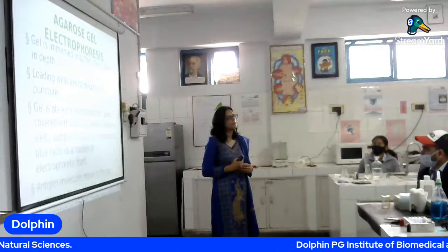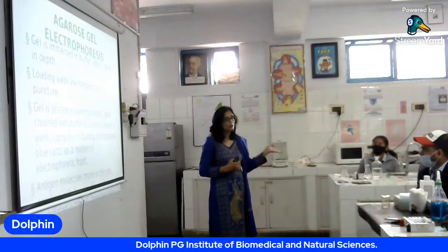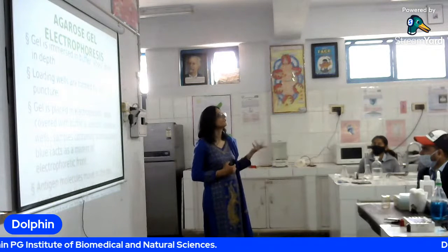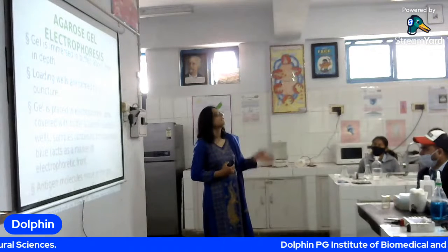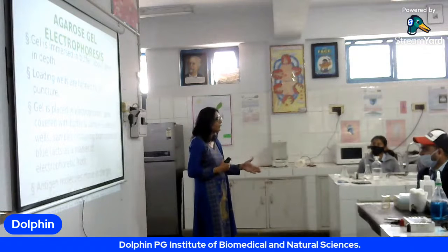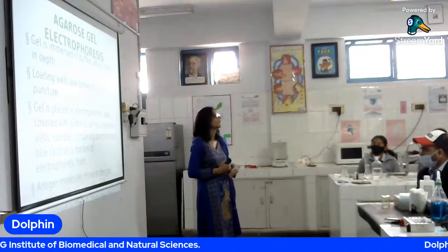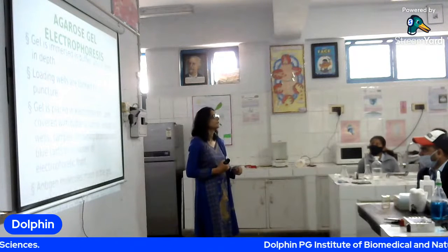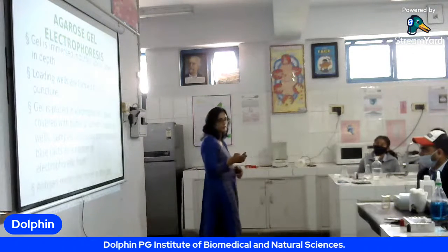You have also seen the bands, but the difference between that technique, immunodiffusion, and electrophoresis is that we didn't consider anything of the charge of the molecule. Here we are considering the charge also. The antigens are negatively charged. जो हमारे पास एंटीजन है, we have loaded it in such a manner कि हमारे एंटीजन्स negatively charged हैं, and the antibody is present in the gel, and the antigen is going from the negative to the positive side.